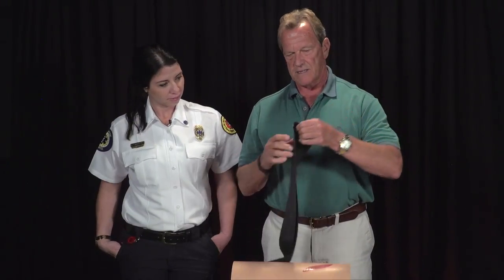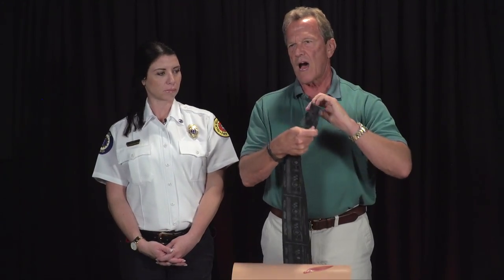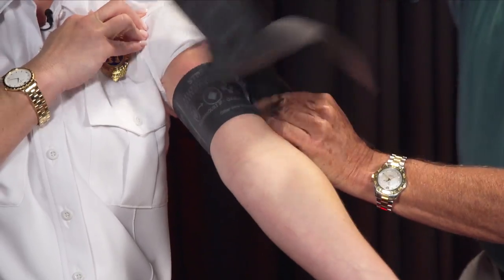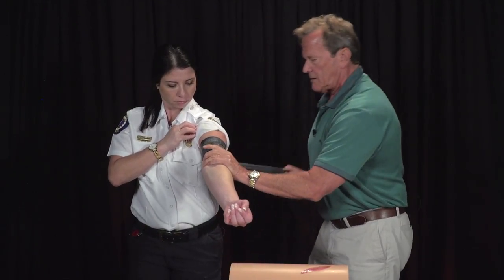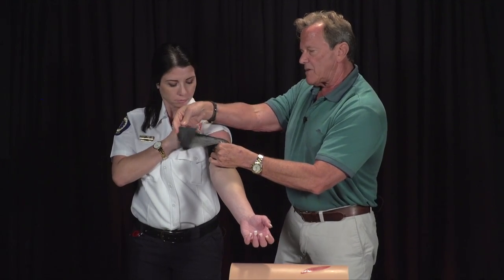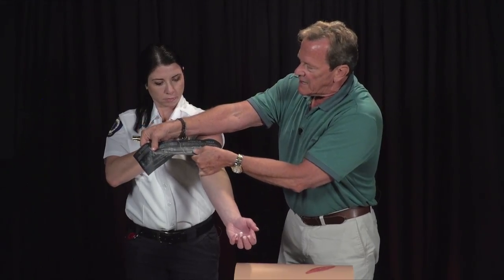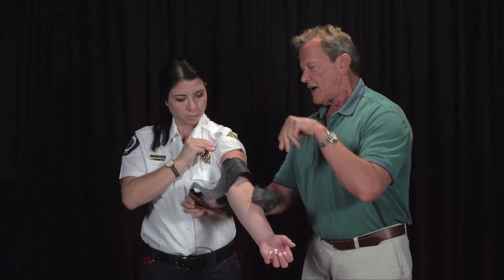The SWAT-T tourniquet is kind of like a cut piece of inner tube. SWAT stands for Stretch, Wrap, and Tuck. In the same injury situation, you wrap it and as you wrap it you can make it really tight. Then the last thing is you just tuck it back in. It's a little more difficult to use, especially with blood — if it gets wet, it gets slippery. But as you stretch and wrap it, the ovals turn to circles. These are often used by police agencies.